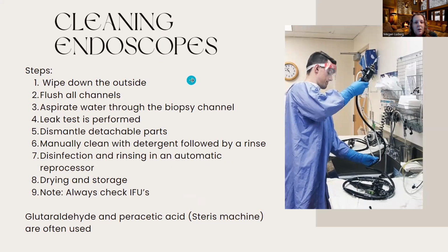So you always wipe down the outside. Your surge tech should be doing this, wiping the outside, at least with a 4x4 or something in the OR at the point of use before ever sending it to be cleaned in the decontam area. So always clean at the point of use. You're going to flush the channels, aspirate the water through the biopsy channel. Like I pointed out, a lot of these have a biopsy channel. Tissue can get stuck in those, so for sure, make sure you're aspirating those.